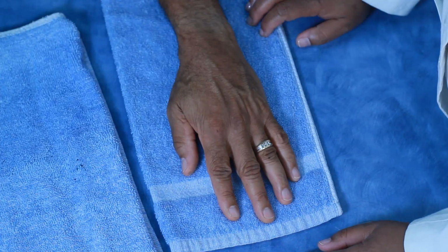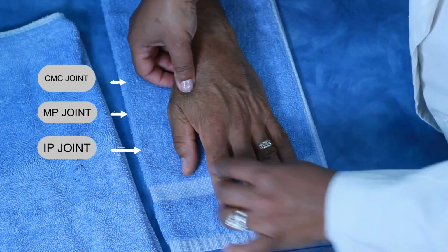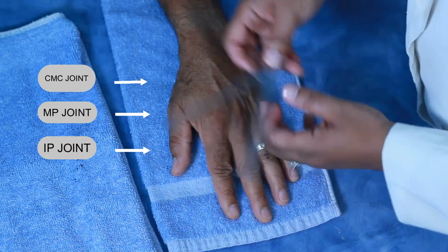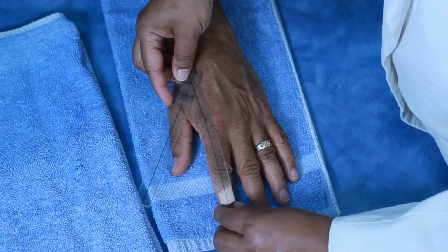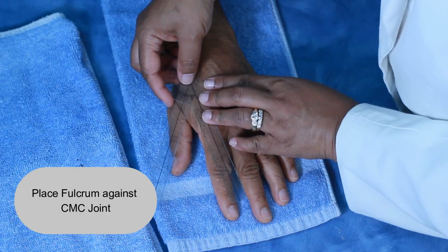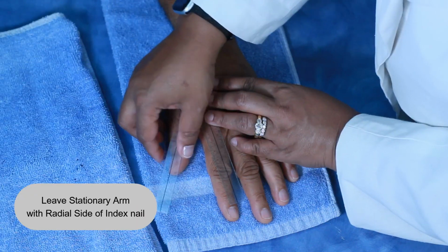Okay, we're going to start with measuring thumb range of motion, and there are three joints that we're concerned with in the thumb. The CMC joint, which is almost invisible, but you can actually tell when it's moved, so you can find the joint. We'll measure the MP joint and the IP joint. So we find the fulcrum, which is going to be right at the CMC joint. We leave the stationary arm with the radial side of the nail, and the movable arm will be measured with the ulnar side of the nail of the thumb.